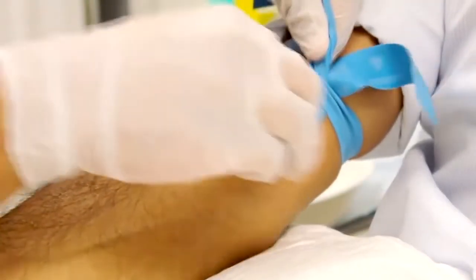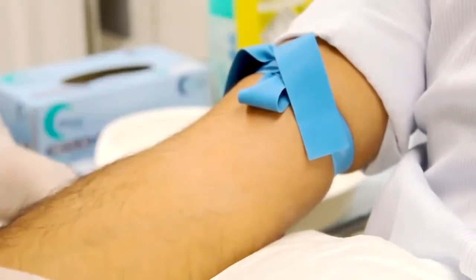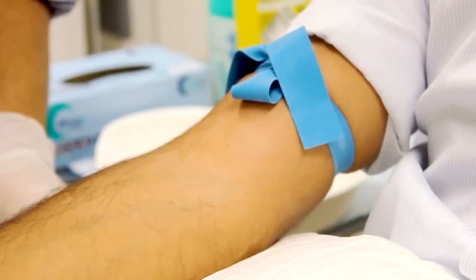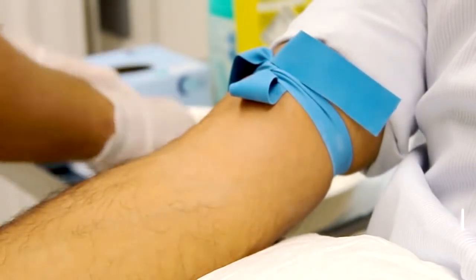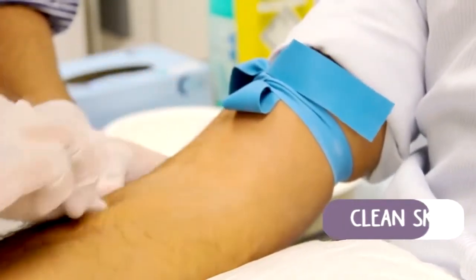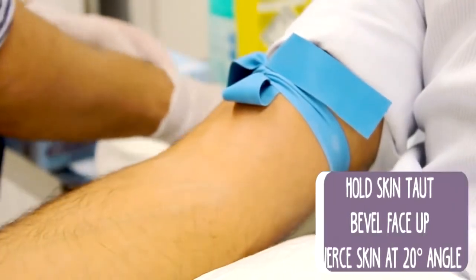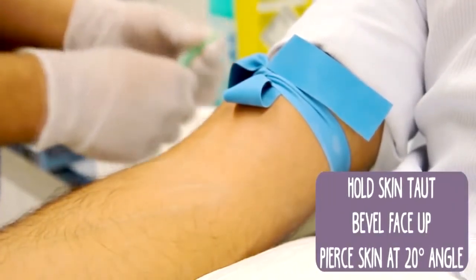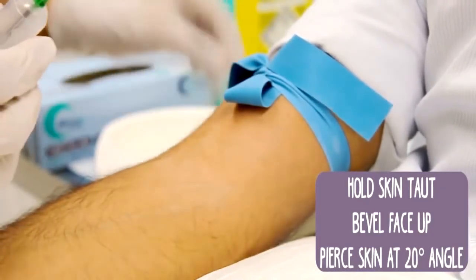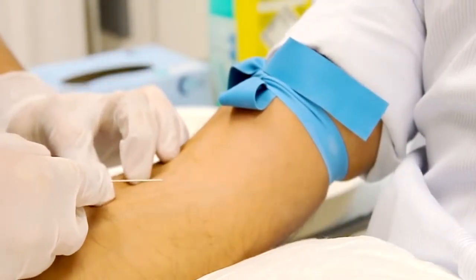Once you're happy with the position, apply the tourniquet. This is a better technique to tying it because you can actually release it with one hand. Once you've chosen the vein you want to go for, clean the area with a chlorhexidine wipe. Get your needle ready with the bevel side facing up. Go in at about a 20 degree angle, making sure that with your non-dominant hand, you're holding the skin taut. This helps anchor the vein that you're going into.